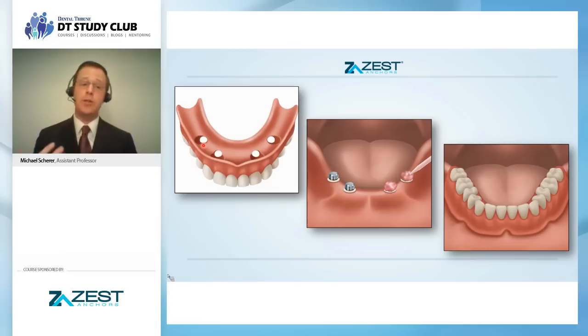Now, there's a few different ways to do this. Obviously, one way to do it is to not create a relief hole, and you just inject a little bit of material and allow the denture to go into place, and traditionally the material will go everywhere. And this is the way that I used to do it. However, almost exclusively, this is the method that I use now. And this doesn't have to be a very big hole. It can be a small hole.